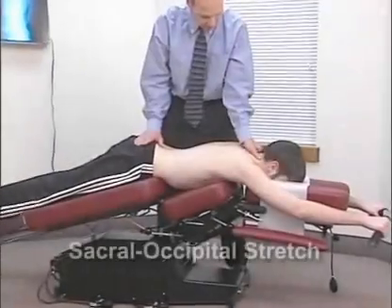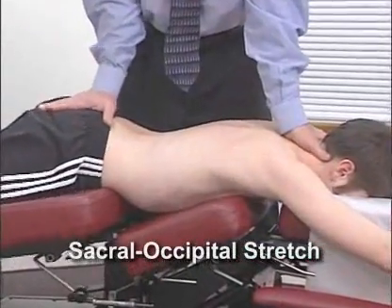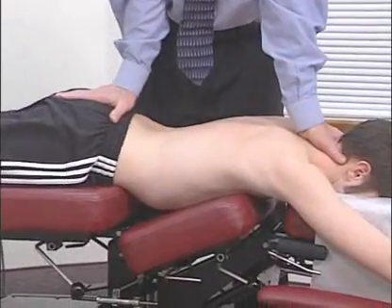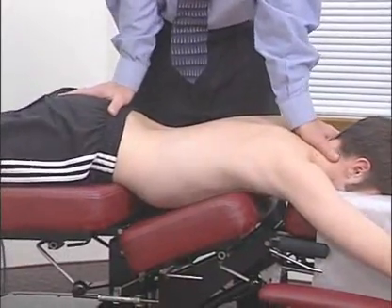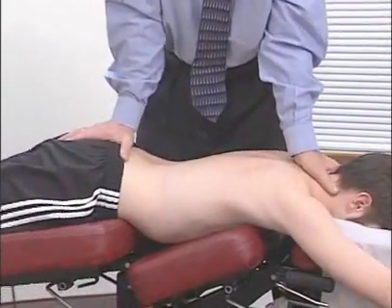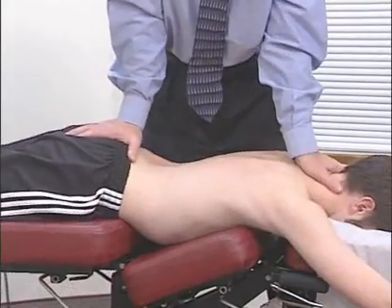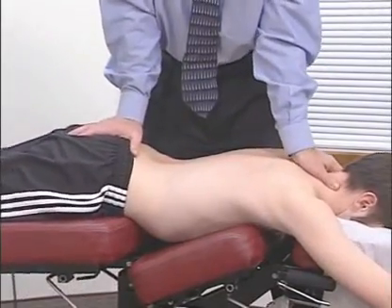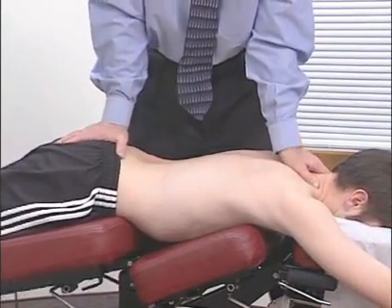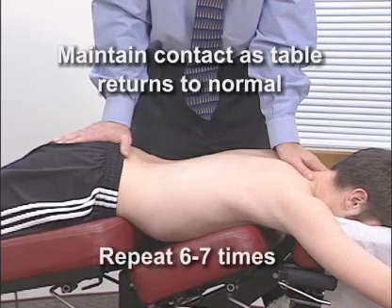The sacrooccipital stretch is applied by placing the superior hand cupped at the base of the occiput. With the inferior hand, place the firm palm-hand contact on the sacral base with the fingers pointing down. As the table descends, keep the elbows straight, lean over the patient, and apply an even pressure to the occiput, pushing upward. At the same time, the inferior hand is holding the sacrum down. Release all pressure, but maintain a contact as the table returns to normal position. Repeat 6 to 7 times.